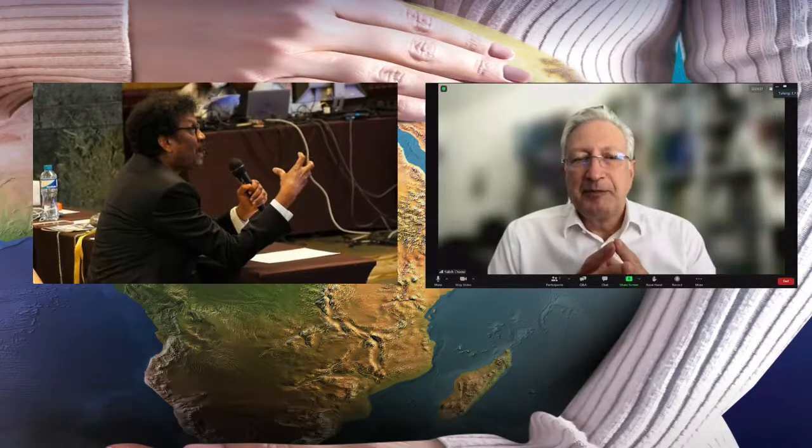I look at the G illustration, and that's how I learn to do STIC from your experience. I'm really surprised why STIC is not taking over. Something like OmniView or biplane, which I learned from you, I found sometimes quite time-saving and quite good tools which you can apply for everyday practice. But I'm so surprised it's not taken up in a big way.